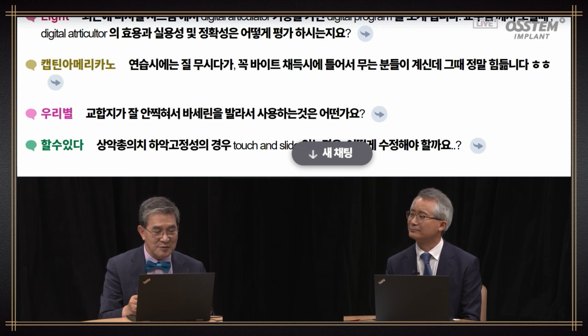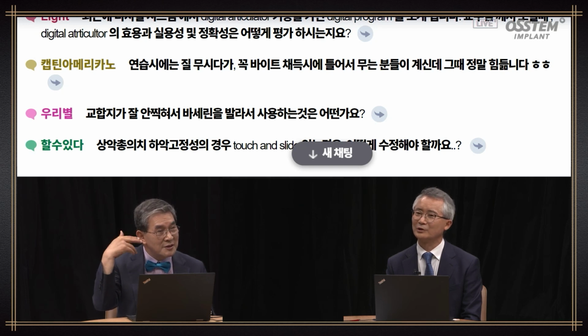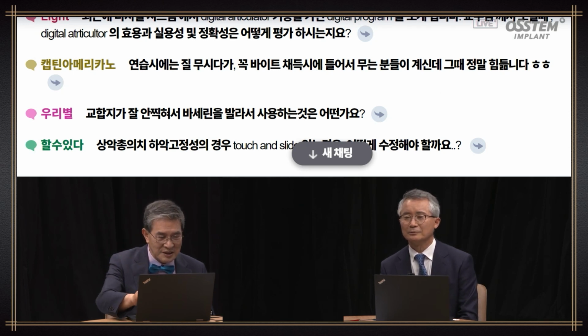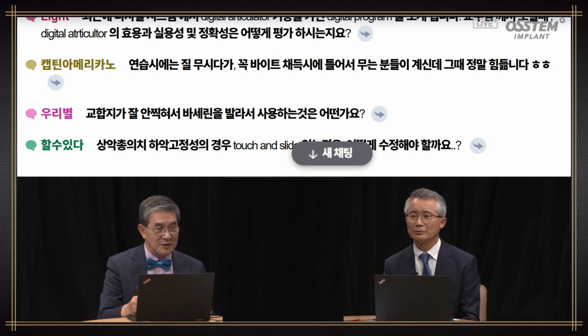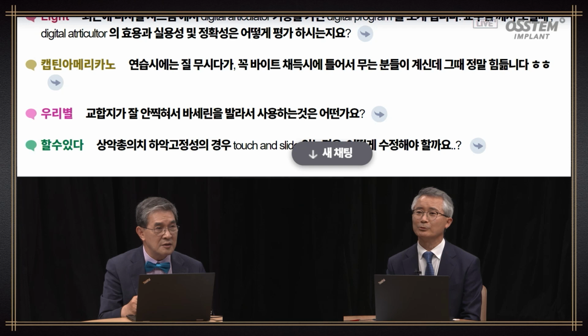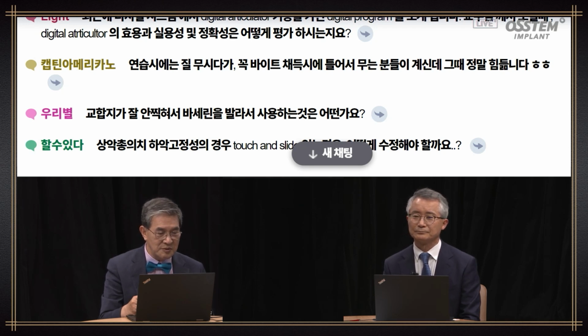In that case, you have the patient bite down on a cotton roll for about 2 to 3 minutes or 5 minutes. You need to do deprogramming and then proceed. Also, when guiding CR, we can have the patient stick their tongue towards the back or retract the tongue. You need to have the patient practice.